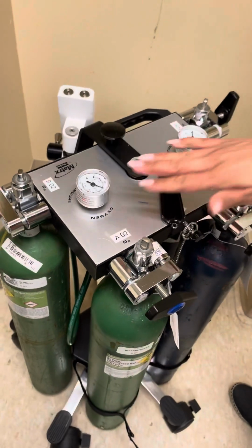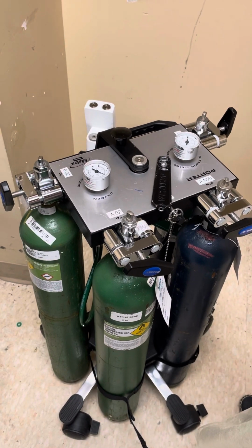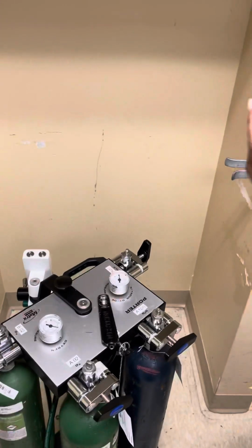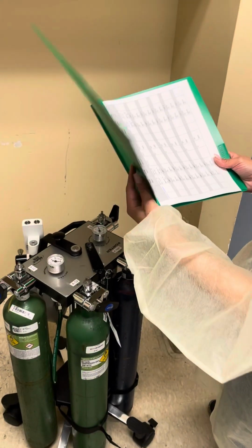And that's it. Make sure then once you change the tank, you record your new recordings in the book that you have. Make sure it matches the unit, but make sure you record that your final reading is what you have for the tank. So we changed A, so then make sure you put A back at 2000.